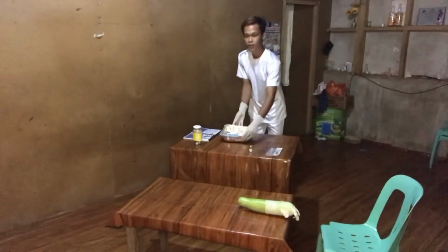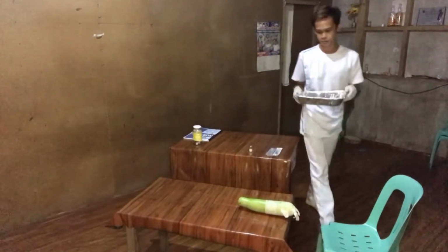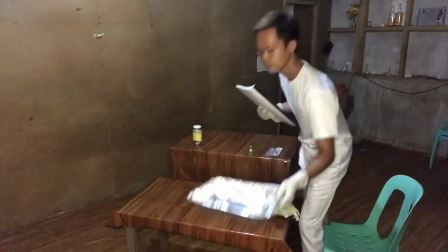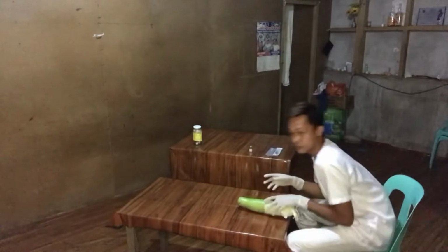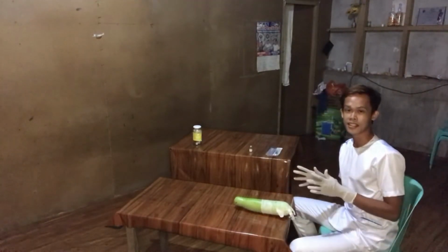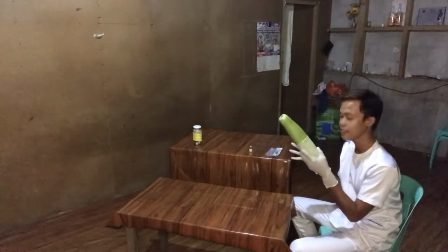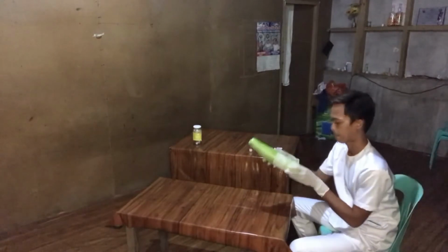For this time, we're going to transport the medication to the patient. Now we're going to perform injecting the medicine via the intradermal site, and we're going to use green vegetables for administering the medicine. Let's assume that this is an intradermal site of the patient.